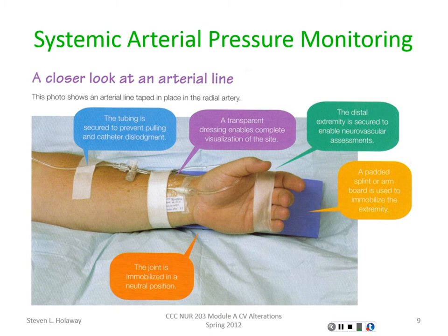They're designed to transfer pressure, because when I'm measuring the blood pressure, it works on hydraulic principles. Basically, I'm seeing a transfer of that pulse from there through this fluid back up to a transducer, and that transducer's then allowing that to be transferred into an electrical signal I can read. But that tubing has to be in place.